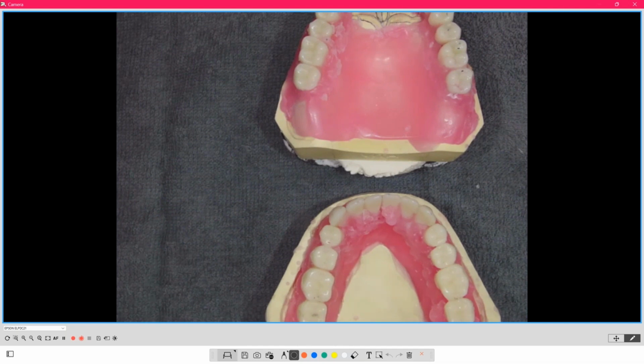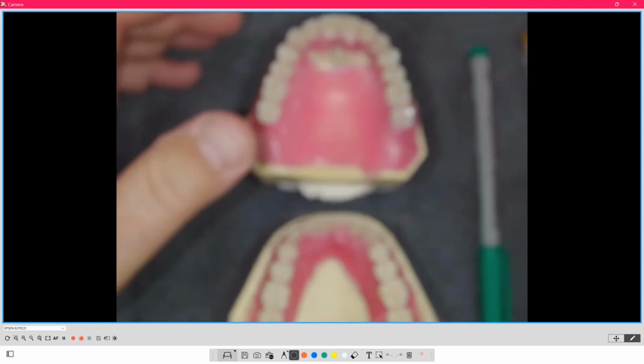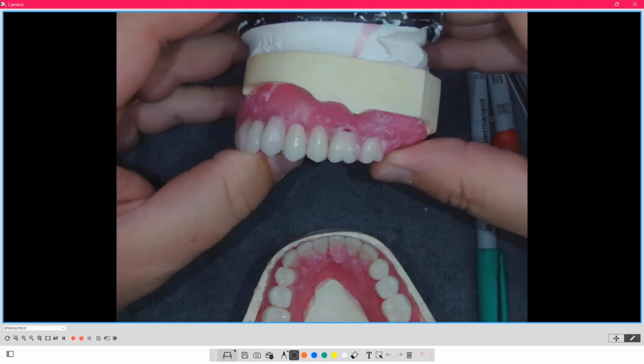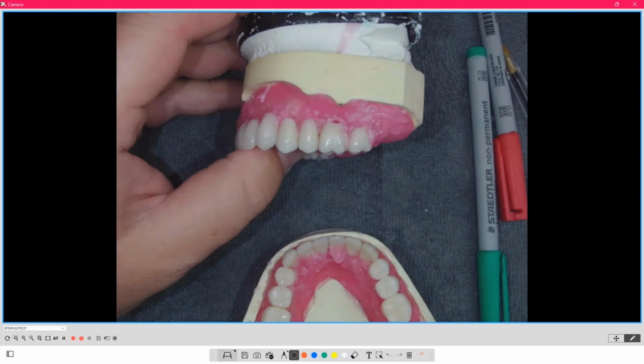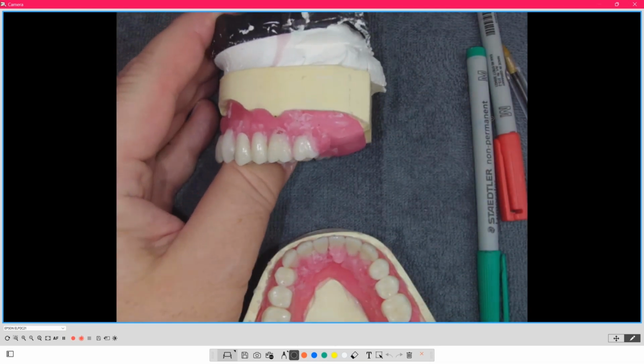So the next question was an explanation of when I talk a little bit about the mortar and pestle and how it worked and why. So again, these are VITA lingualized, so it's VITA lingual form. Let me grab a template, sorry.